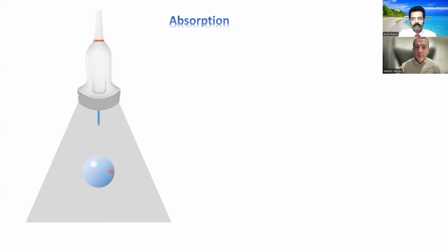And in fact, the loss of signal intensity is quite catastrophic, and it's particularly catastrophic at certain object interfaces. So, for example, we might have a highly absorptive structure, such as a gallstone in the field of view. Yes. And this gallstone may absorb so much ultrasound energy that very little, if any, penetrates beyond the object. And this will then result in a black band beyond that object, where the sound is attenuated, or there was complete loss of visualization. So, for example, a shadowing artifact is a very good example of where sound has been absorbed. It can also be reflected, not necessarily absorbed.